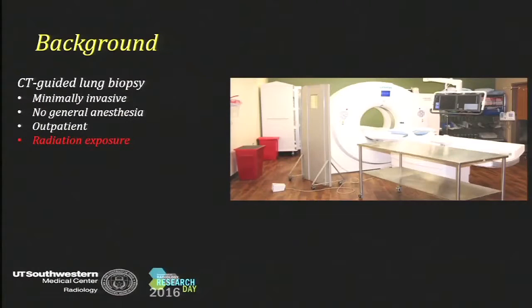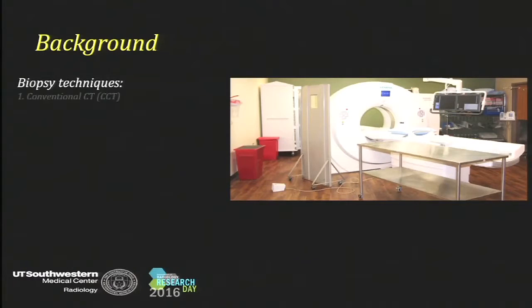So CT-guided lung biopsies are preferred over the open surgical method because they're minimally invasive, they don't require general anesthesia, and they can be done on an outpatient basis. However, they do expose the patient to ionizing radiation. Now, CT biopsy techniques come in three different flavors.